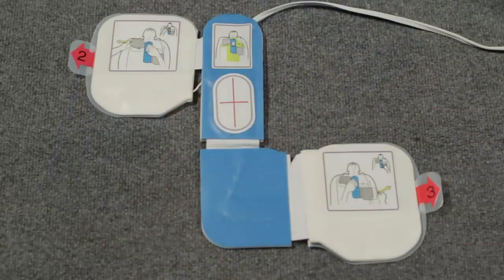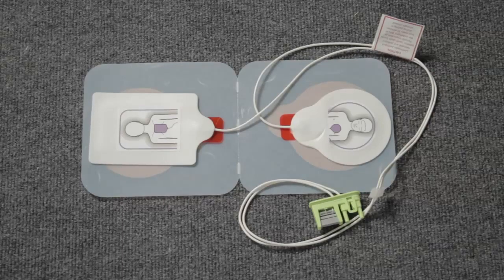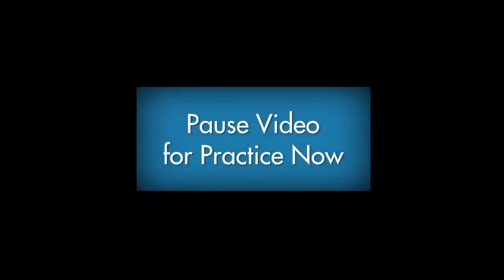Always use adult AED pads for adults. For children less than 8 years old or weighing less than 55 pounds, use pediatric pads. If they are not available, use the adult pads. Never use pediatric pads on an adult. Now practice using the AED in your classroom with your instructor.